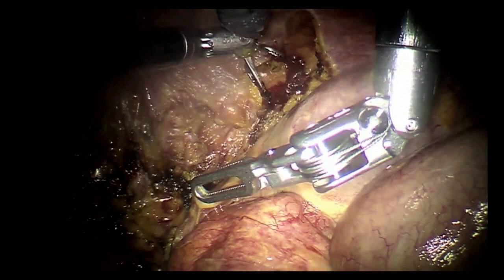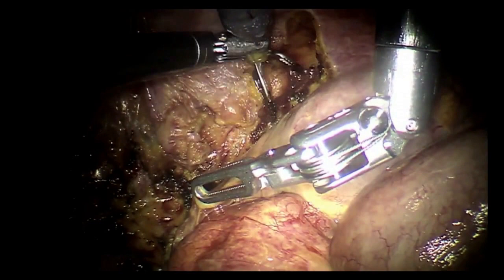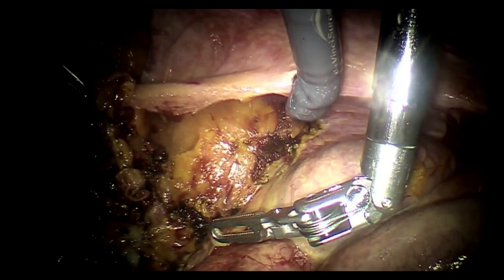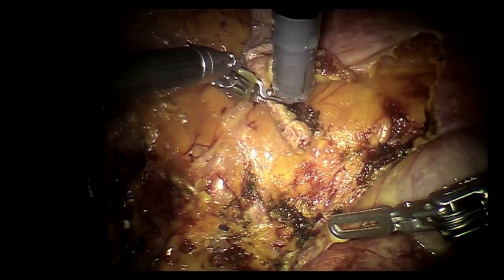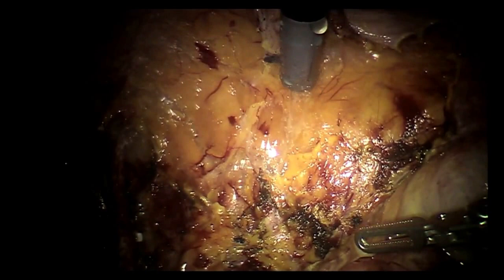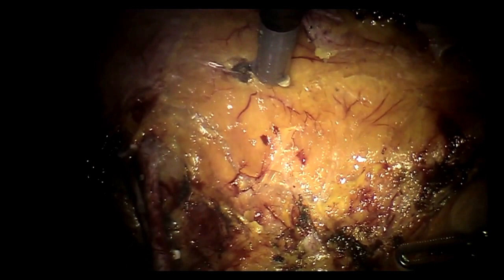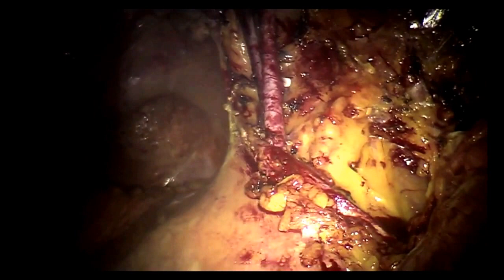Some of the things that we tried in the initial one or two cases but then stopped was use of the gel port. We don't think it's necessary at all. It adds unnecessary expense, doesn't help. So we just put the kidney in through an incision and close the incision. Have you ever thought of putting the gel port in and doing the anastomosis through there, open? No, I have zero experience with gel port in my life. That's the way I want to keep it.